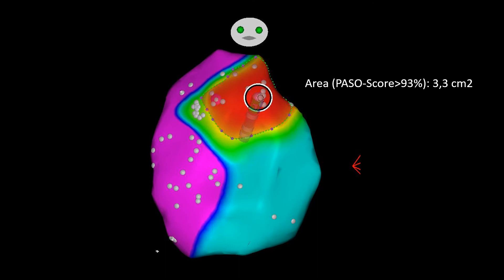This figure shows the pace and correlation mapping in RAO projection. As you can see here, the area with a pace mapping score over 93% equals 3.3 square centimeters. And this is one of the reasons for limited efficacy of pace mapping guided ablation in patients with vanishing PVC during catheter ablation procedures.